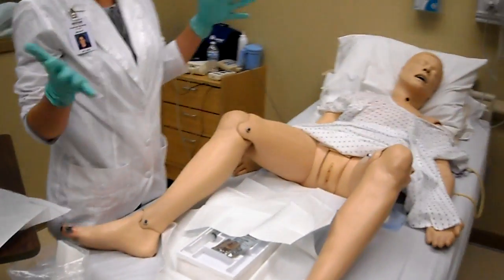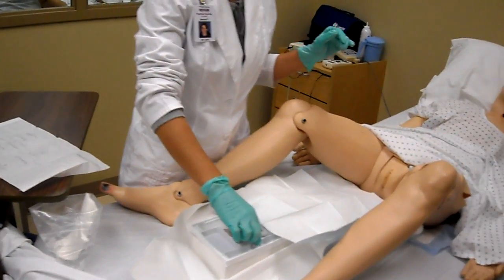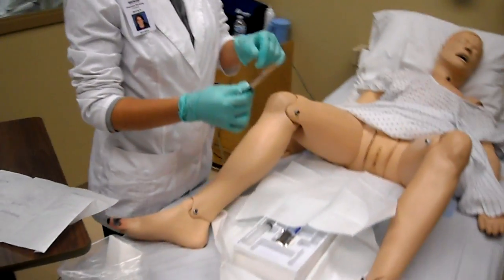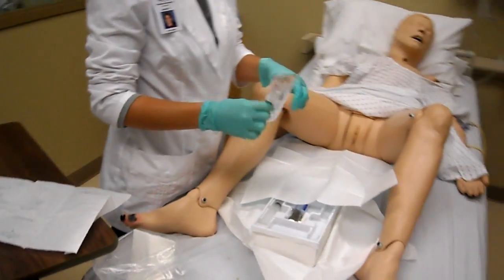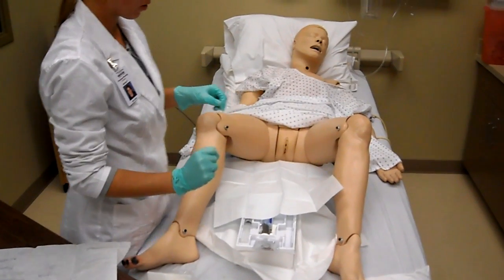Once you get your sterile gloves on, you need to keep your hands above your waist. Then we're going to take the cotton swabs out — open them and place them right there so they're ready to go.